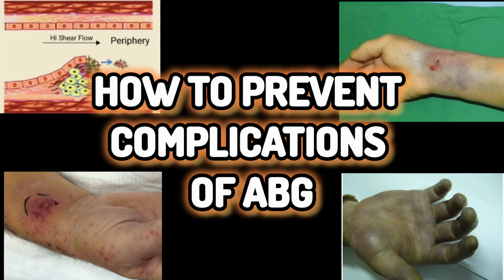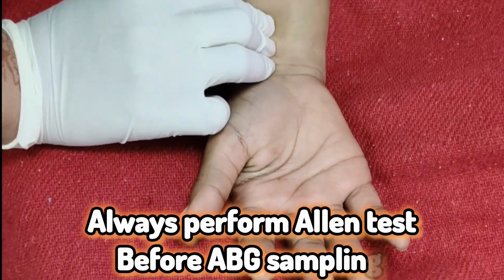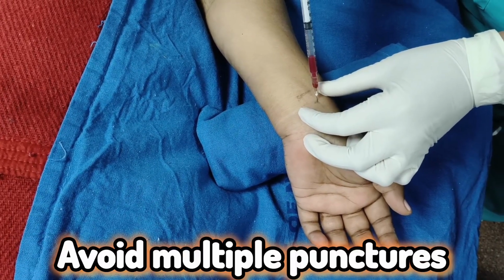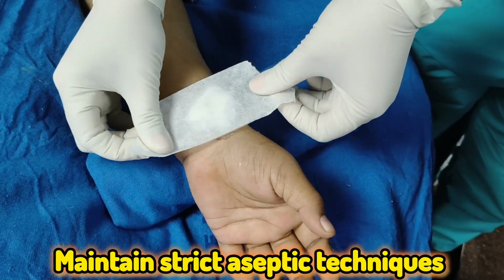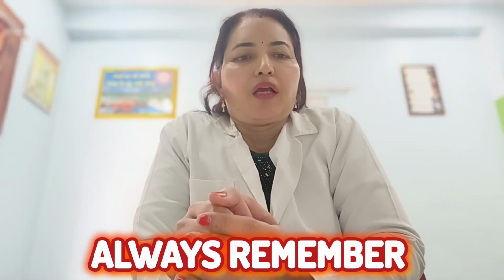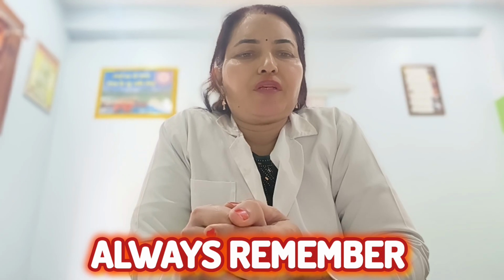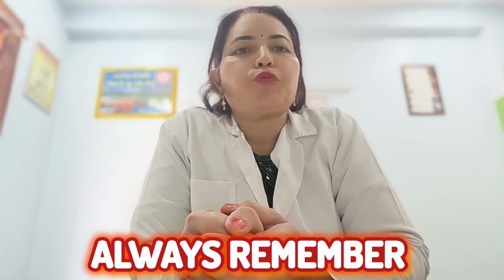And how to prevent complications? Always perform the Allen test, use correct technique and angle, avoid multiple punctures, apply adequate pressure after the procedure, and maintain strict aseptic technique. Always remember, correct ABG sampling is as important as ABG interpretation. A well-taken sample gives more accurate results and improves patient safety.